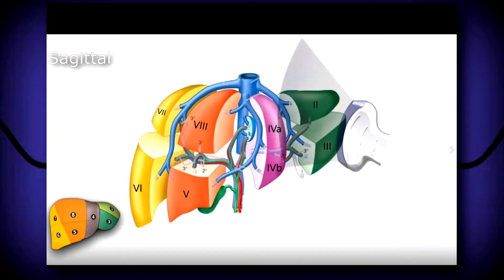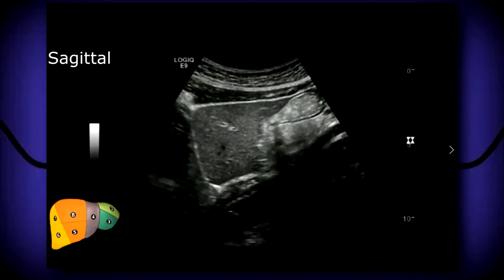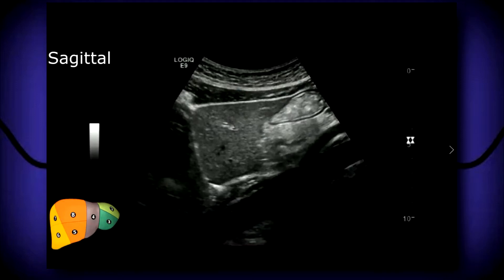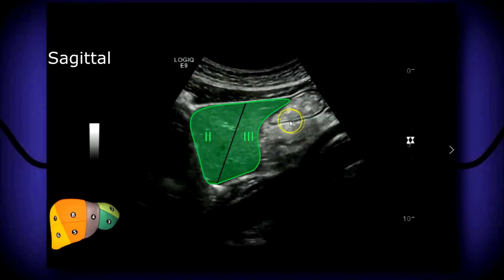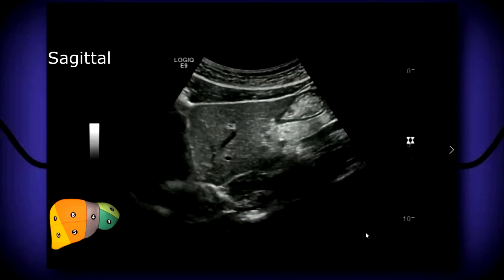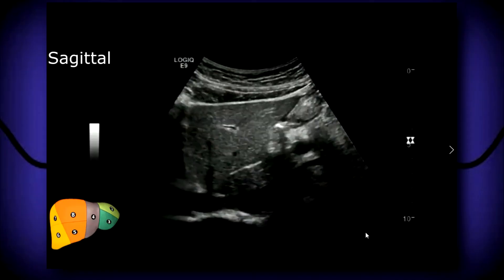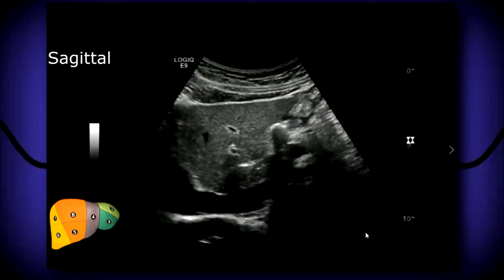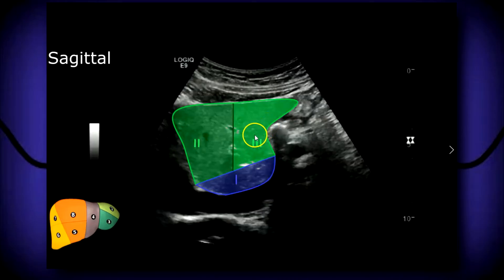With the probe on segments 2 and 3 in sagittal, here you have your aorta with superior segment 2 and inferior segment 3. Moving more medially, you have the IVC, segment 1 (caudate lobe), and again segment 3 and segment 2.